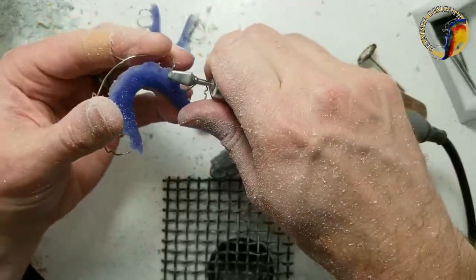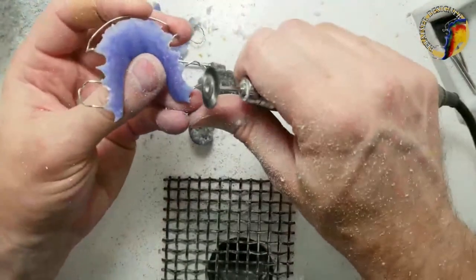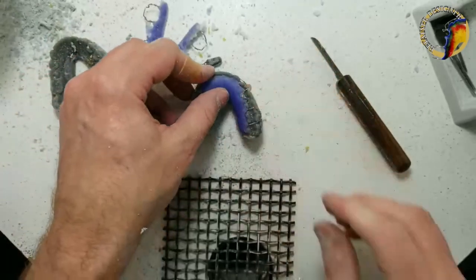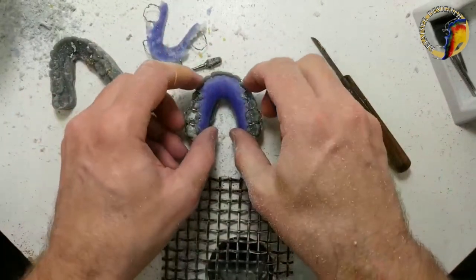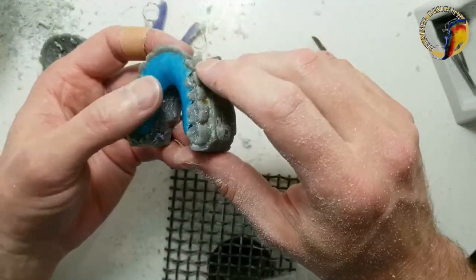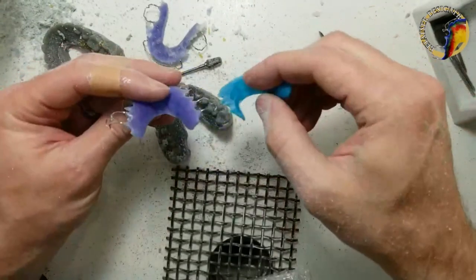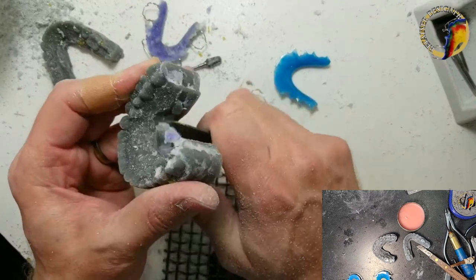Let me shorten these a little more so they look better on the model and are more comfortable for the patient. The downfall of the bristle brush is you get those little metal hairs stuck in your socks, underwear, everywhere. One thing you can do when replacing the acrylic is put the old acrylic base back on the model — you can tell if something has gone wrong with it. You can see if one side is a little taller than the other, meaning something was missing — a little piece of wax or a missing scan area.